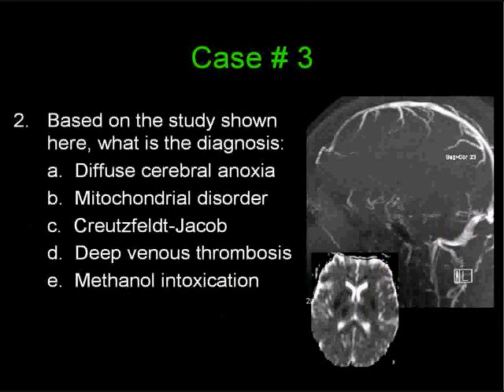Let's go on to question number two. In the inferior aspect of the screen I'll show you the same ADC map as before, but also an additional image — an MR venogram. The question is: based on the study shown here, what is the diagnosis? A, diffuse cerebral anoxia. B, a mitochondrial disorder. C, Creutzfeldt-Jakob. D, deep venous thrombosis. And E, methanol intoxication. Which is the diagnosis?